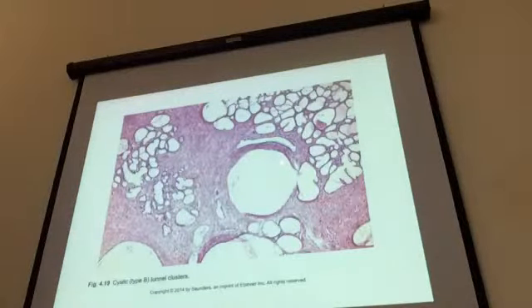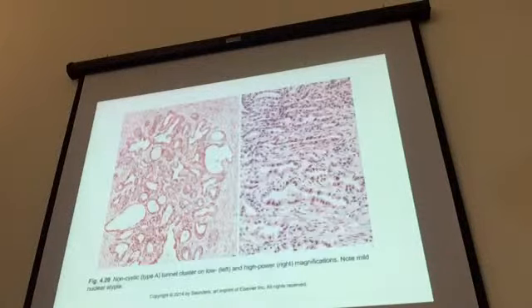So here's an example of a more cystic type, dilated. And you see they have this lobulated structure. They're closely packed together. So that can sometimes raise concern for cancer because they're close to each other. Here are some examples of the non-dilated types. A cluster of glands, as you see here, minimal dilatation, but they can also have a little bit of atypia. It's more of a degenerative type atypia, not very much real high-grade type of atypia, but could raise some concern.